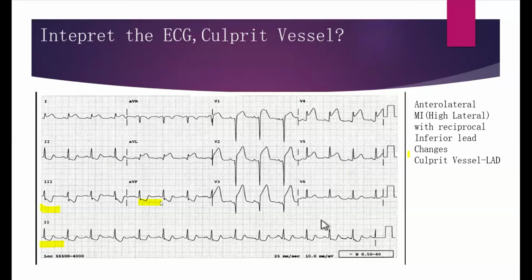All right. So anterior, posterior, inferior, looking at the lateral. The reason for that is the way the heart sits. The inferior part is looking opposite the lateral part of the heart.